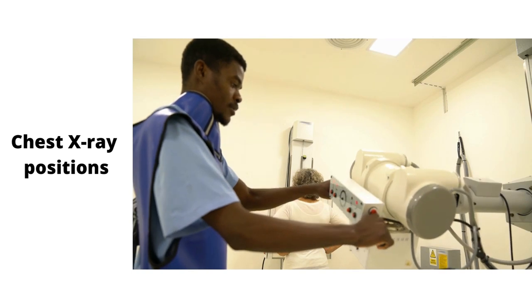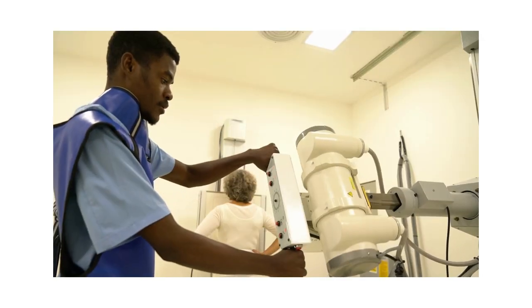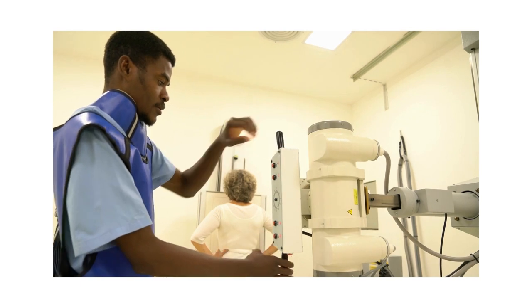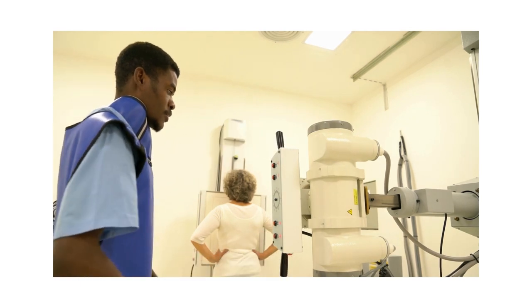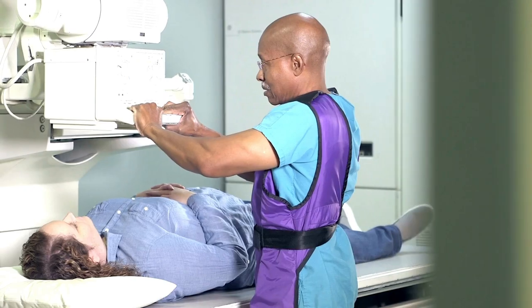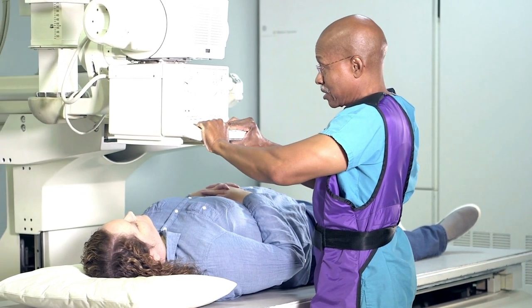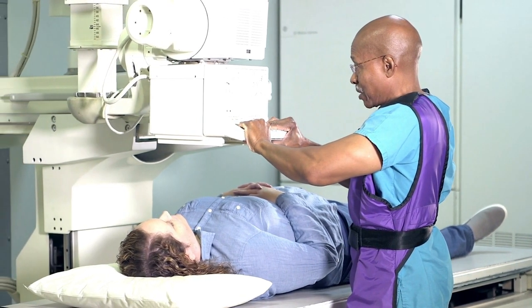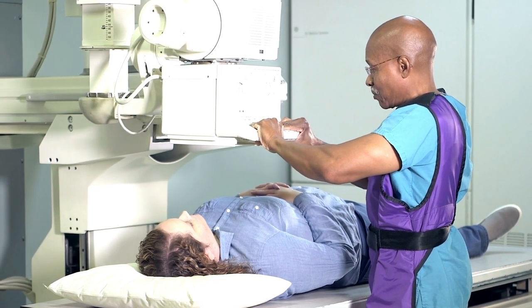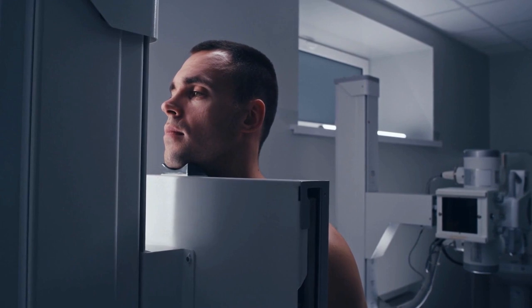Another basic is chest x-ray positions, which refer to the different ways in which a patient is positioned and the direction of the x-ray beam during imaging. These positions are essential to obtain specific views of the chest, allowing for comprehensive evaluation of the lungs, heart, bones, and other structures.